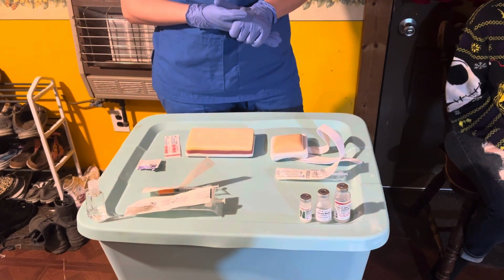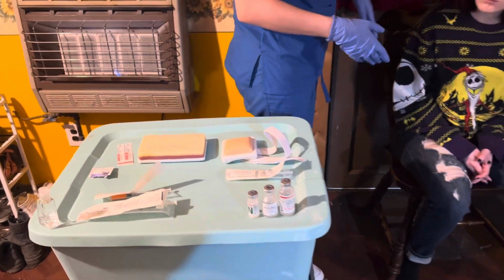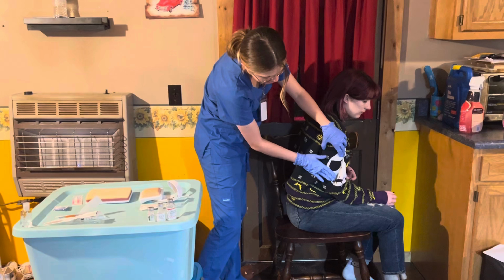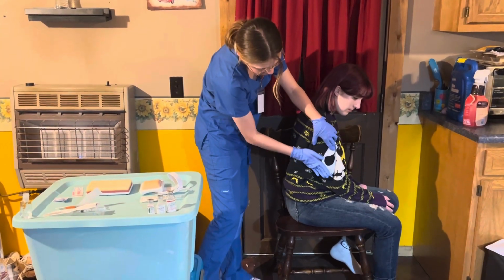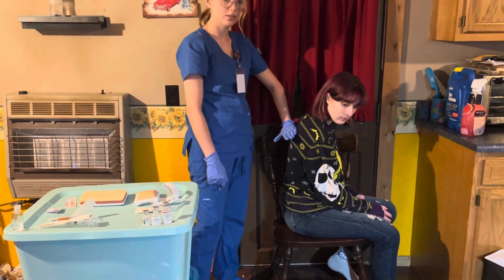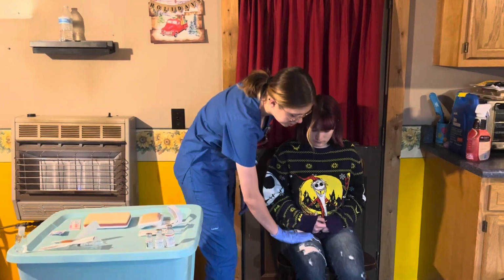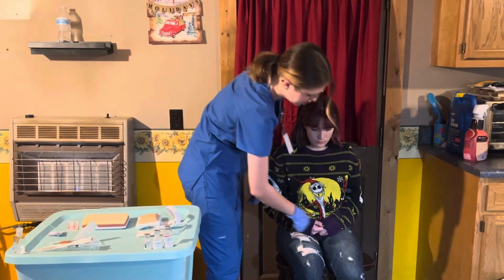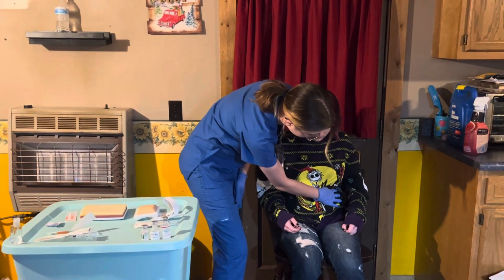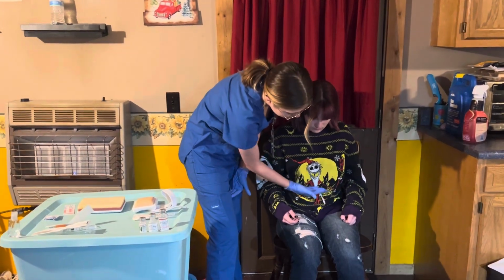So my next injection will be subcutaneous, which I would put on clean gloves. And the sites for this injection are the outer aspect of the arm and the tricep. You could also do this one subscapular in the upper back. Alright. You can do it on the anterior aspect of the thigh, through here, in the umbilical region, from the iliac crest to the costal margin, avoiding the umbilical area, but in the abdomen, on the upper side preferably.